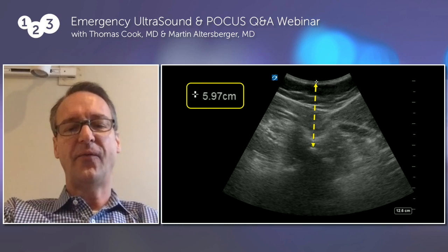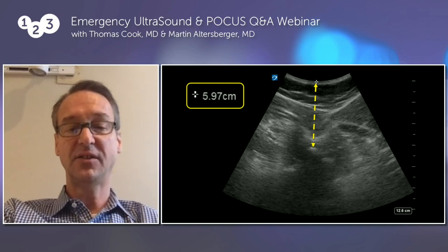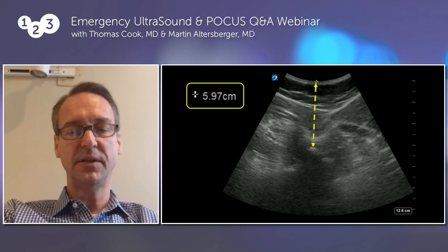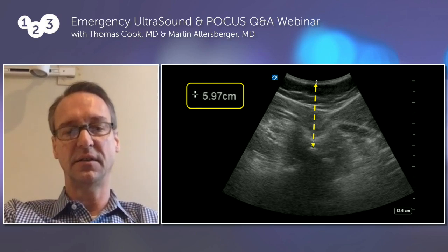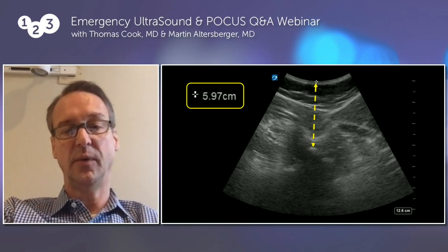Here we can see how far that distance is. So if we look from the surface of the skin down to the tip of that spinous process, 6 centimeters. That's just to the tip of the spinous process. And your average spinal needle is about 8.5 centimeters. So you really don't leave yourself a lot to work with once you place this needle into the spinal column. You might actually have to push the hub of the needle into the soft tissue to be able to enter the column. And this is very frequent for me. Or we have to get a special needle. We can get them up to about 12 centimeters for some of our patients.